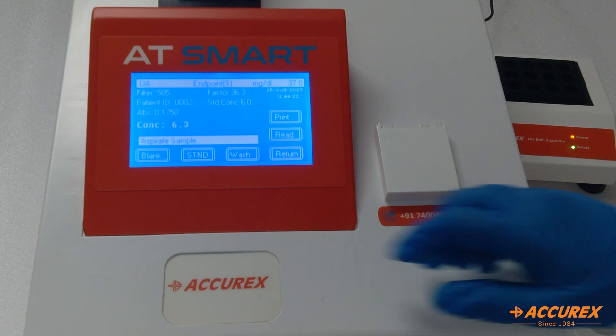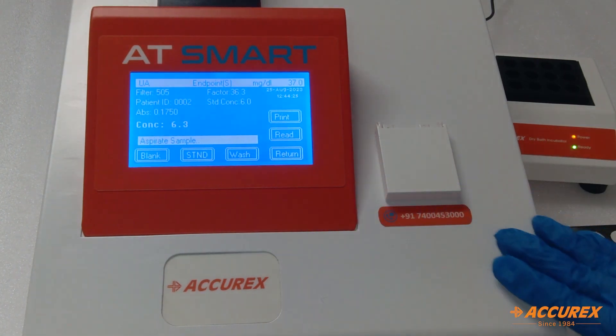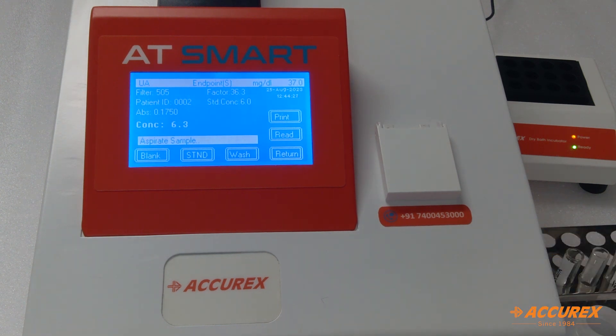The sample value is 6.3. In this way, we can check many more samples within 5 minutes.